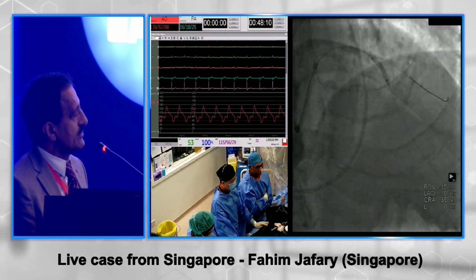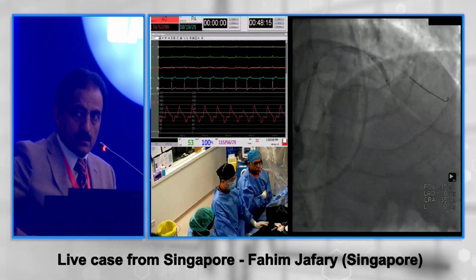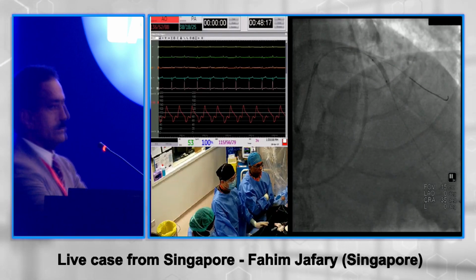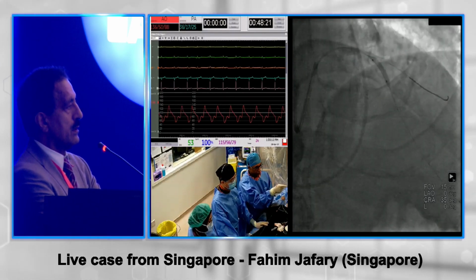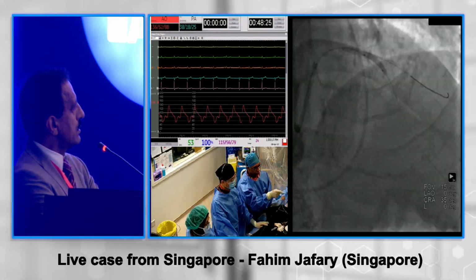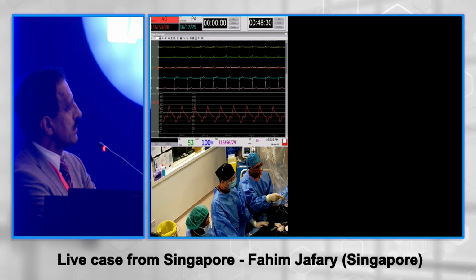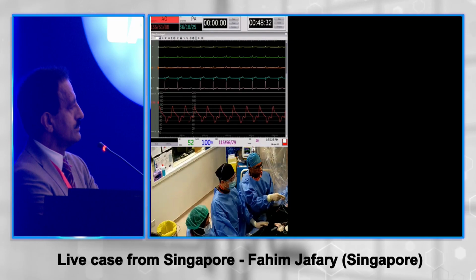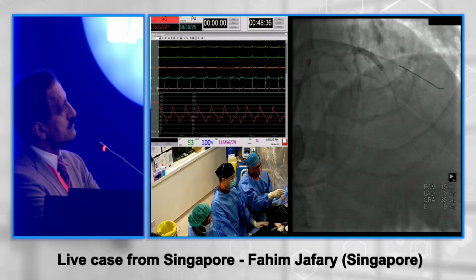Okay, Fahim, go ahead, please. Yeah, those are excellent points, Ashok, and thank you for those. So we went ahead with a 3.0 NC, and I'll just play the pictures rapidly in the interest of time. So that's a 3.0 at 20 atmospheres. Next, please. Another 3.0 at 20 atmospheres. Next. And that's a 3.25, I believe, at high pressure, like 22 atmospheres.